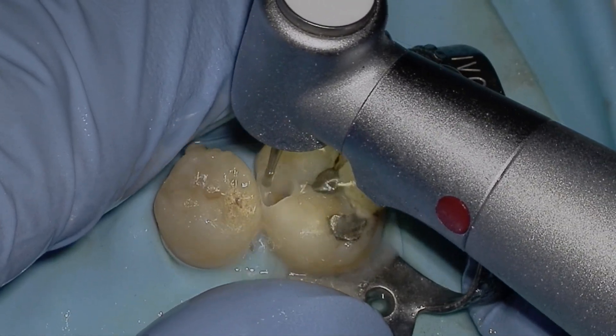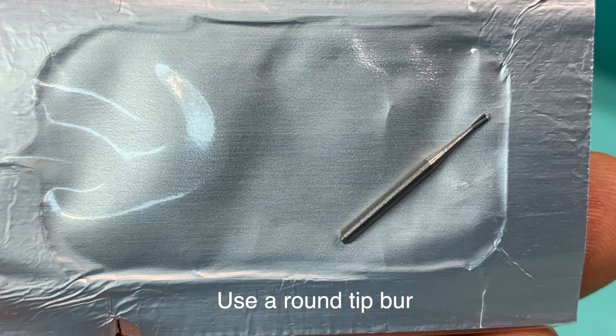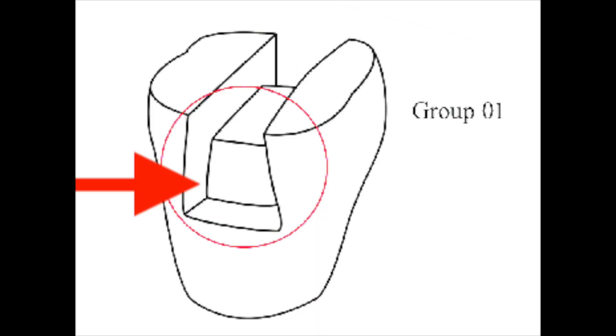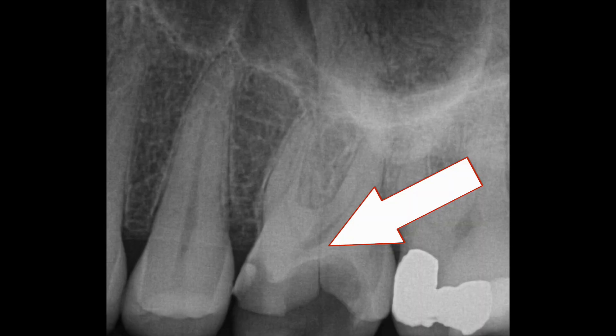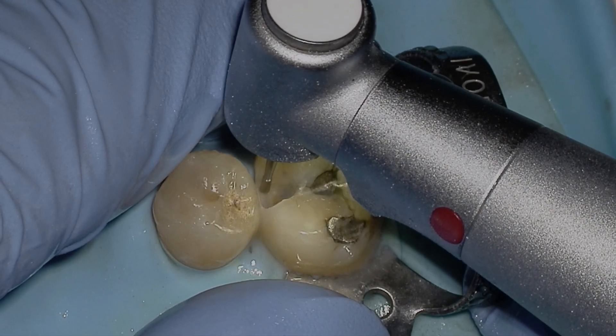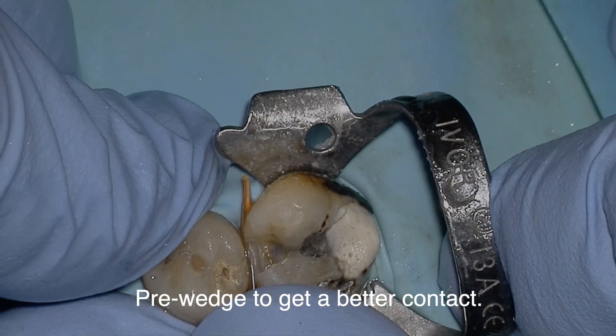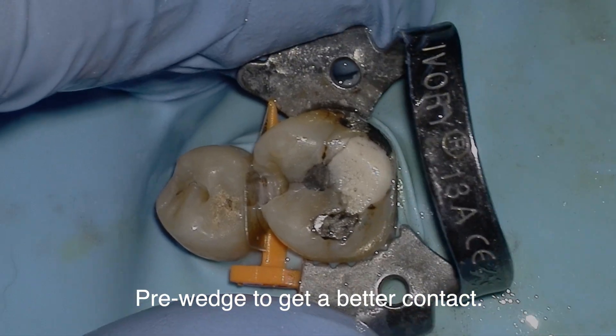Tip number two: use a round tip burr — this is a 330 that's pre-sterilized in a package, so you don't have to reprocess it. Most of us were taught using a square-angled burr like a 557, with perfectly sharp line angles. But I see nothing but cracked teeth day in day out, and I truly believe that sharp line angles increase cracked teeth. So use a round-shaped burr.